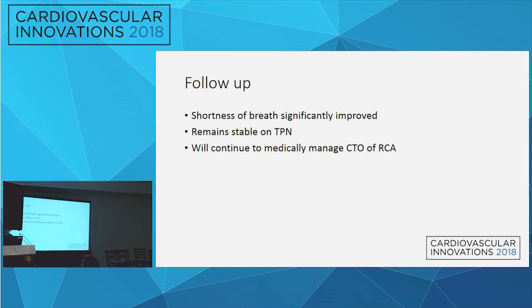So, good case. The only thing I do different is I use fluoro roadmap, so DSA, for axillary puncture. Even if they're breathing, it doesn't move much, and you can just visualize where you want to go. And then I do a DSA picture at the end, because you can have a subtle mushroom cloud or bleeding that regular angiography doesn't detect. So for the completion angio, I always do DSA.